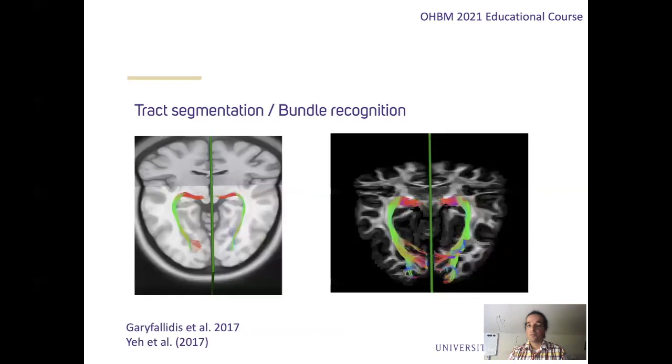Another alternative approach to this uses match between streamlines in streamline space to an atlas. For example, here's an atlas that Frankie developed from the data in the Human Connectome project and published. And here I'm using a method that Eleftherios Garyfallidis developed called RecoBundles. And this method tries to find streamlines whose trajectory matches more or less the trajectory of the streamlines that are in the bundle.